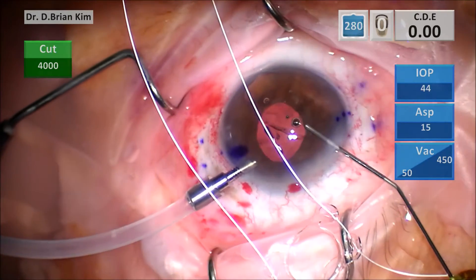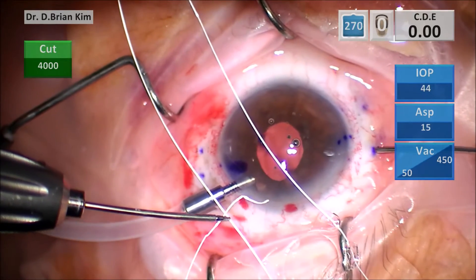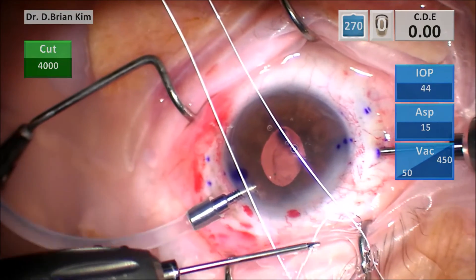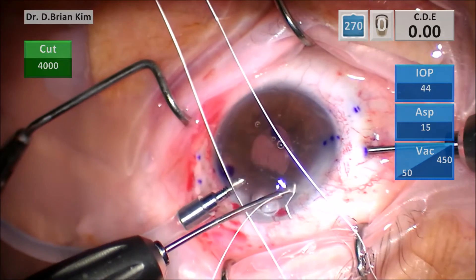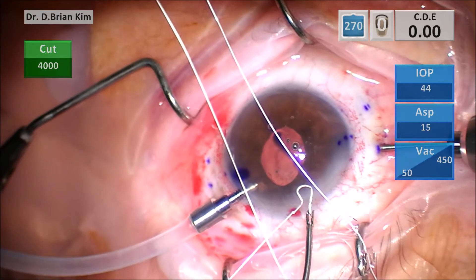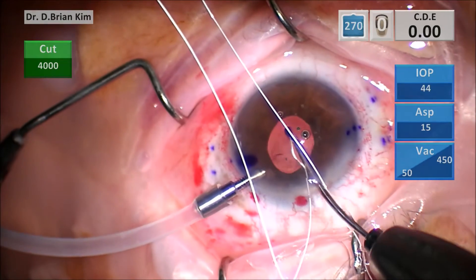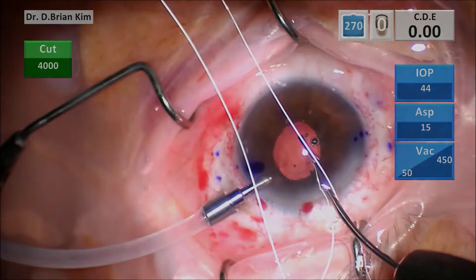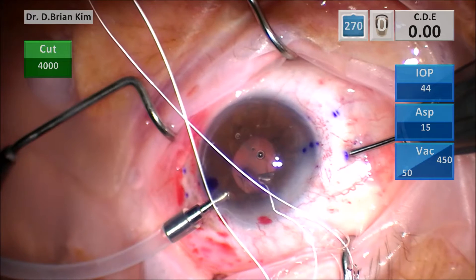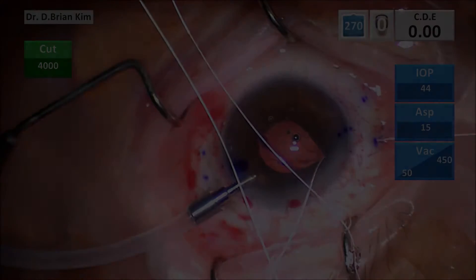I'm injecting viscoat into the anterior chamber just to keep it stable. I saw some videos where they did a two-handed technique of feeding the suture into the anterior chamber while grabbing through the sclerotomy. I found this a little bit cumbersome, mainly because I don't have the muscle memory for those maneuvers. So I decided it might be easier for me to go in with one hand and place the suture in position, then go back through the sclerotomy side to retrieve the suture. This worked pretty easily, especially for my first attempt, so I went ahead and did that for the other proximal side as well.